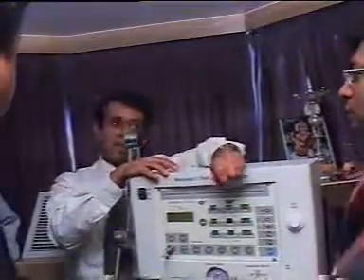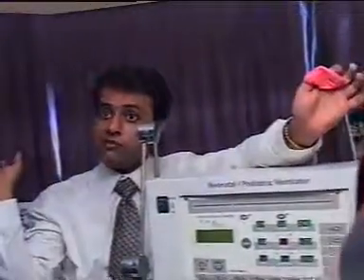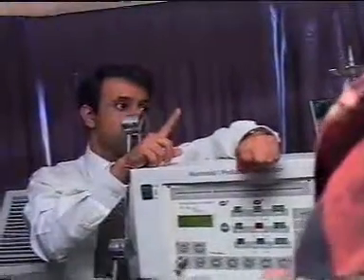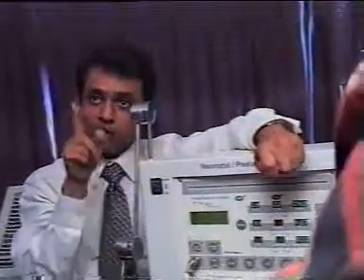Oxygenation will improve. Carbon dioxide actually does not have effect, but on the higher range, you are keeping the alveoli inflated for longer time, not allowing the circulation to go, so it increases PaCO2 also. The effect of PIP and PEEP is opposite on carbon dioxide.